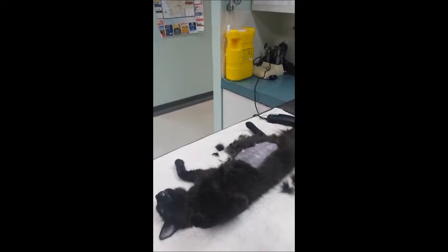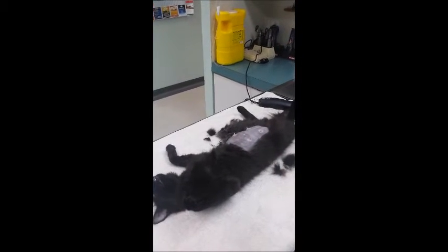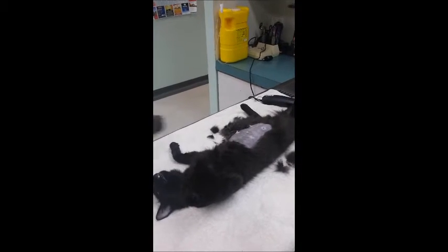Once I've finished clipping the cat, I will get the loose hair with the vacuum cleaner and clear it all away to ensure that no loose hair is moved into the operating theatre.